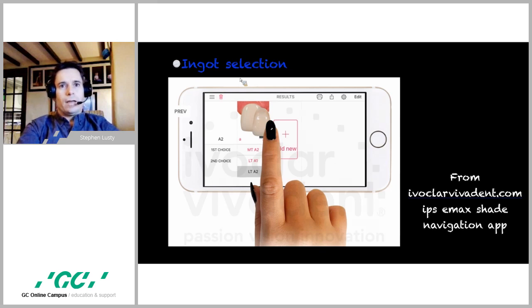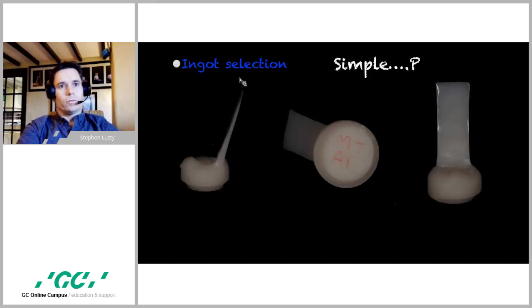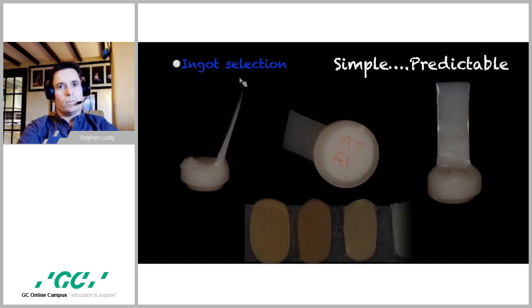So instead of using any table or app, I prefer something more visual that I can compare directly to the shade that I've determined through photography or through seeing the patient. I've accumulated wedges of pressed ingots, which I make with plain denture wax as a counter sprue when investing a single unit. They taper to a feathered edge so that I can measure and find the area which is equivalent to my restoration and simply press it into a flat piece of composite which corresponds with the stump shade. I can then clearly see the resulting color of using that ingot. And if it is too dark or too gray or any other issue, I simply try a different ingot in the exact same way. In this way, I'm certain that even before pressing I've correctly dealt with the underlying color.